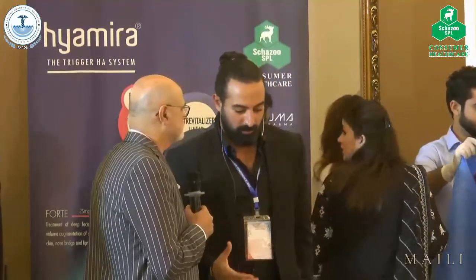So in all honesty, I'm not the right person to speak about cannulas because I don't use them in my practice. I tried it a couple of times. It was nice, but the patient felt a lot of pain, so I avoided it, and I'm not a big fan of blocking the lips either. Because, God forbid, if I'm in the wrong place, the pain is an indication.